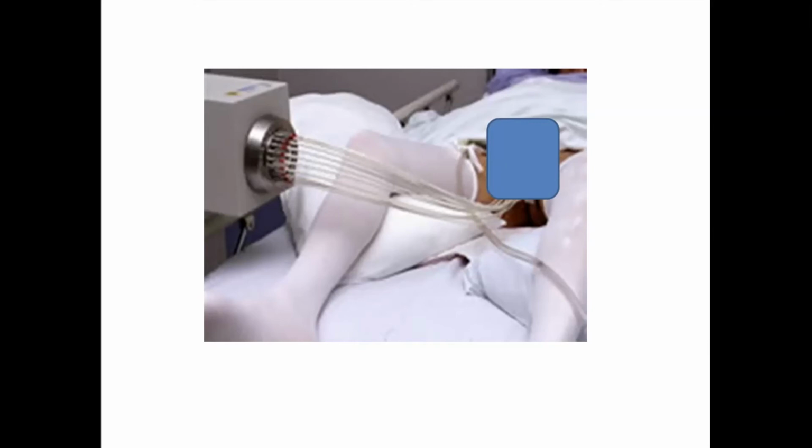The key side effects are that the area which we've punctured with 15 or 20 tubes is inevitably going to become a bit battered and bruised, and it can become quite dark and discoloured due to all the little punctures that we cause. The prostate becomes a bit swollen because, as you'd expect when you shove a bunch of tubes into it, and if it swells, it can swell outwards, but it can also swell inwards. And by swelling inwards, it can narrow the pipe a little bit. And by narrowing the pipe, it can then affect weeing.